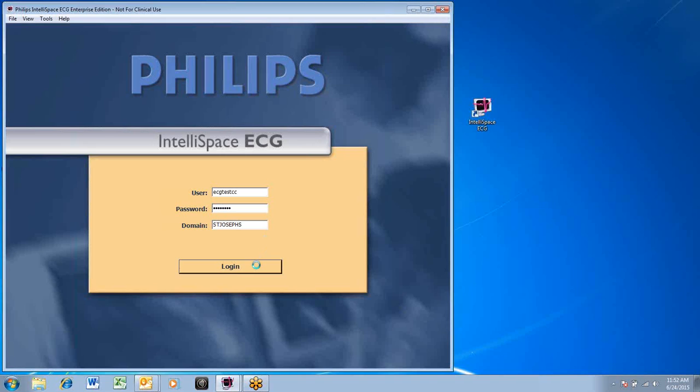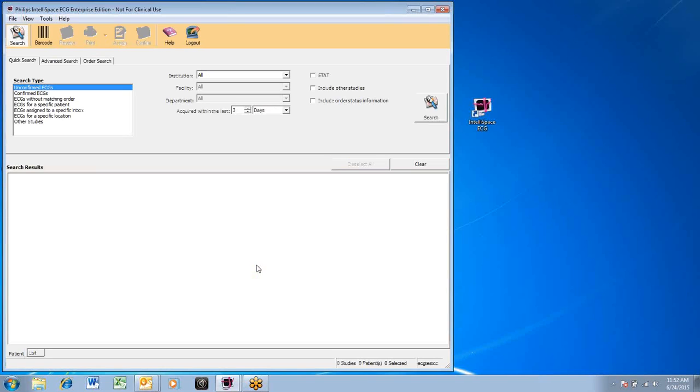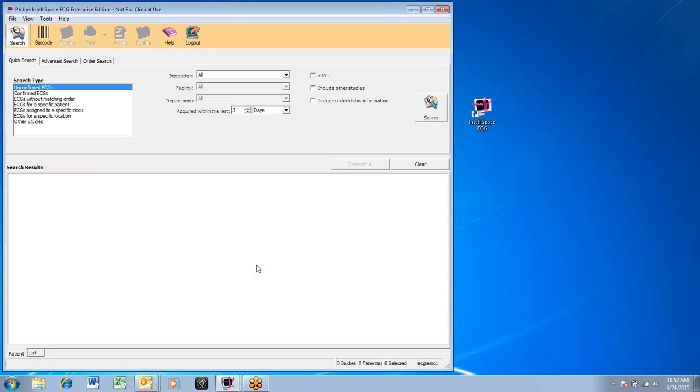The application will open to the quick search screen. Here you will find the navigation button bar on the top of the screen, and you will see the search window for entering your search criteria.